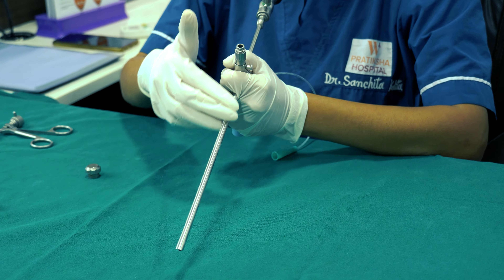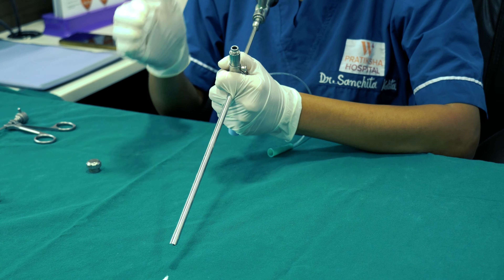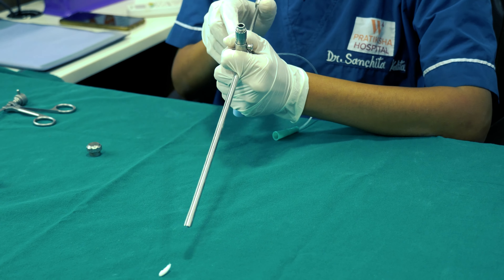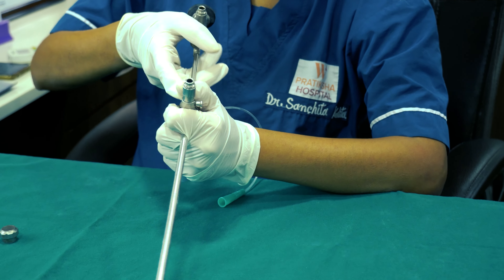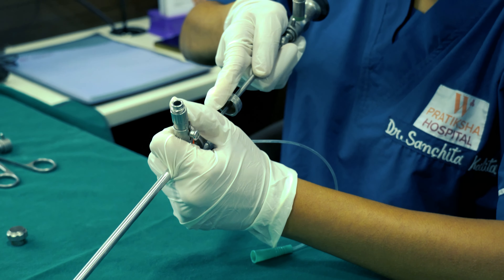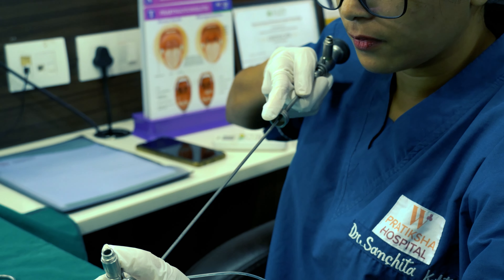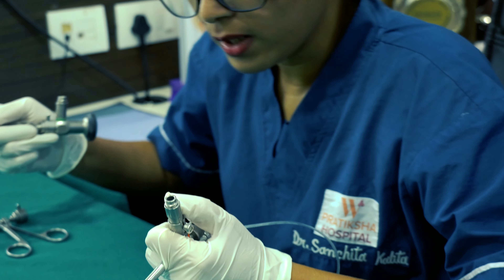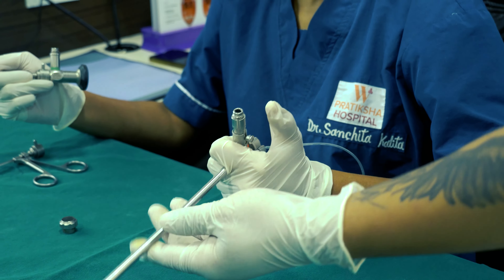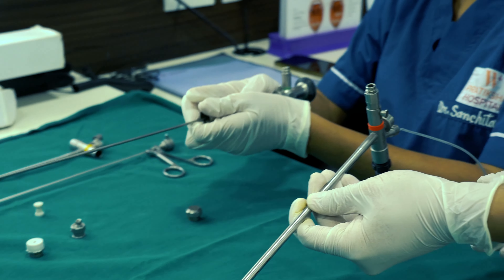Now suppose we have visualized a foreign body — let's say this is the foreign body and we have visualized it. This bronchoscope will remain in this position, and now we'll have to use other scopes for retrieval of this foreign body. So very gently we have to disconnect the bridge with the bronchoscope intact — I will disconnect the bridge gently and take the bridge along with the scope out.